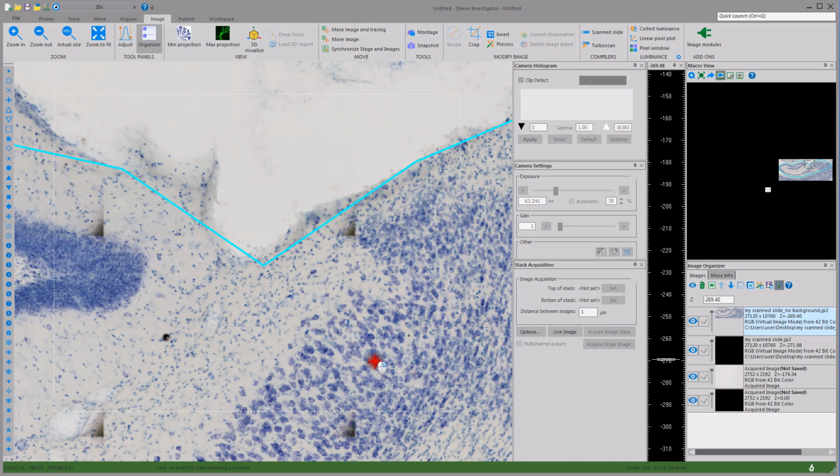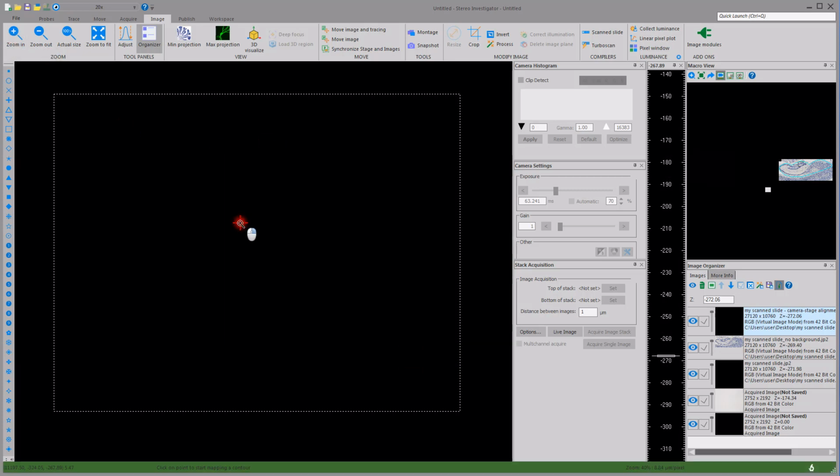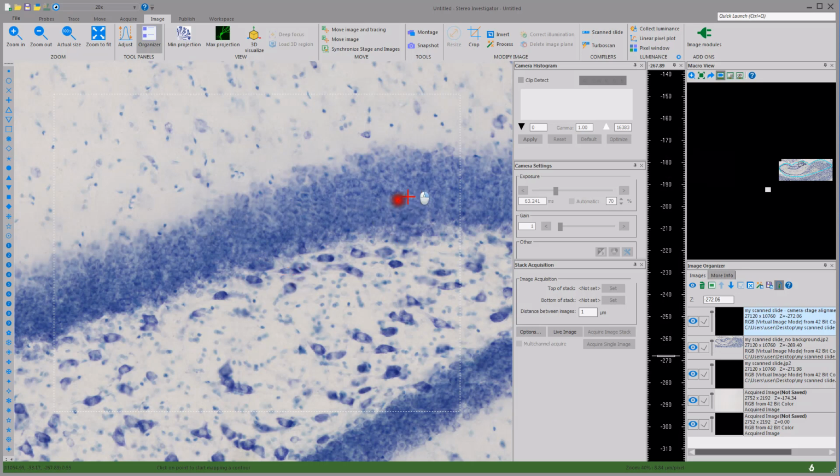Typically, problems like this with an artifact present in every single frame are caused by problems with background correction. Look closely and make sure that your cells align on the seams between tiles to make sure this isn't a camera stage alignment problem. This image looks okay from a distance, but when we zoom in on it, you can clearly see seams between the tiles.